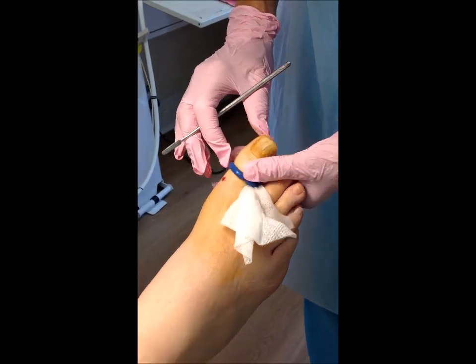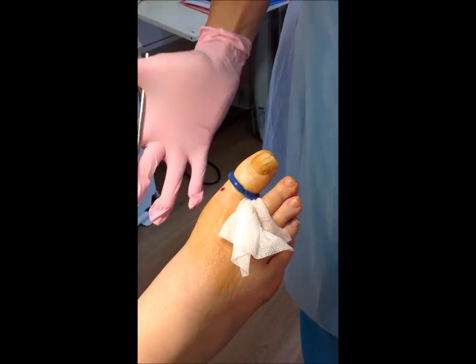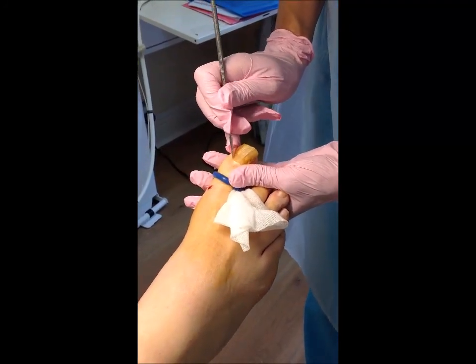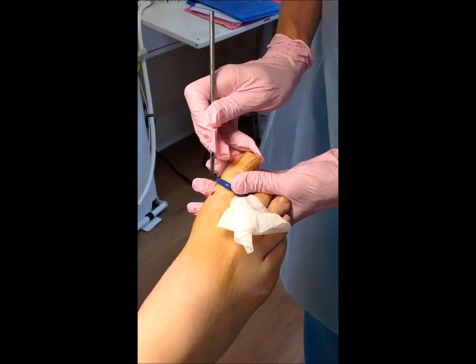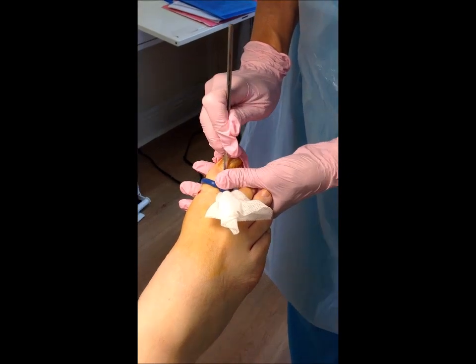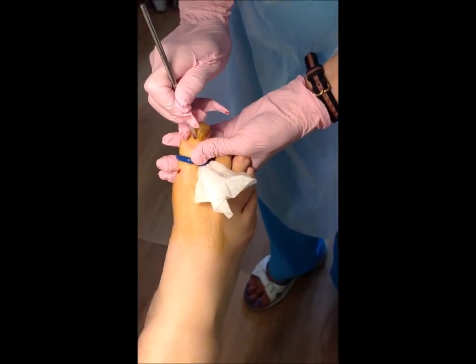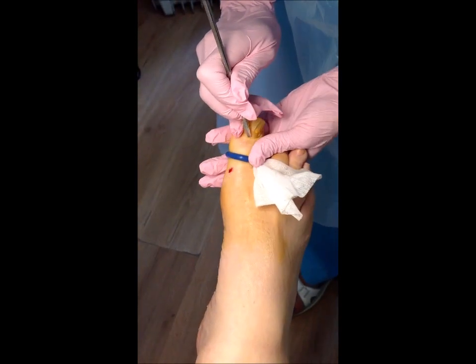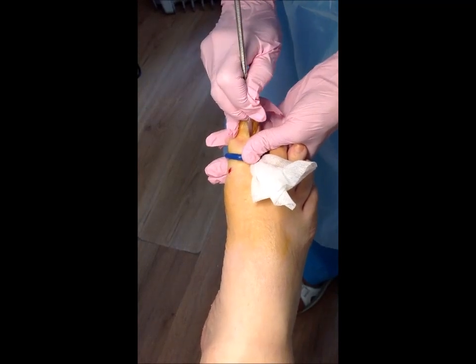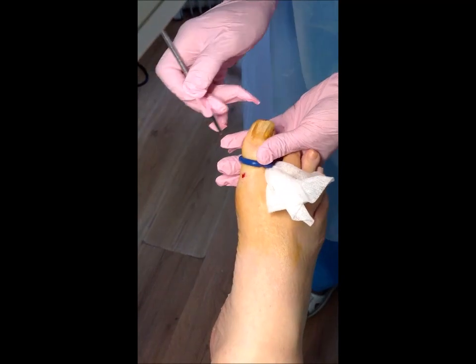We're now ready to take the nail off. It's a very humid day today and it's taken me about half an hour to put my gloves on, but we are now ready to begin. What we normally do first of all is put a tourniquet on — it's easier to work in a bloodless area. So I'm just going to gently prise what you could call the cuticle, or the eponychium — we're just going to remove that at the bottom.